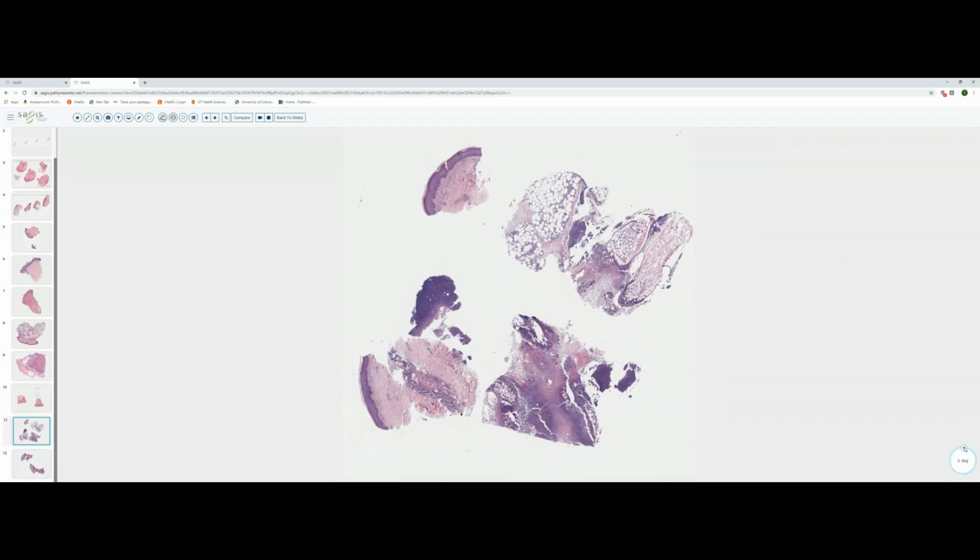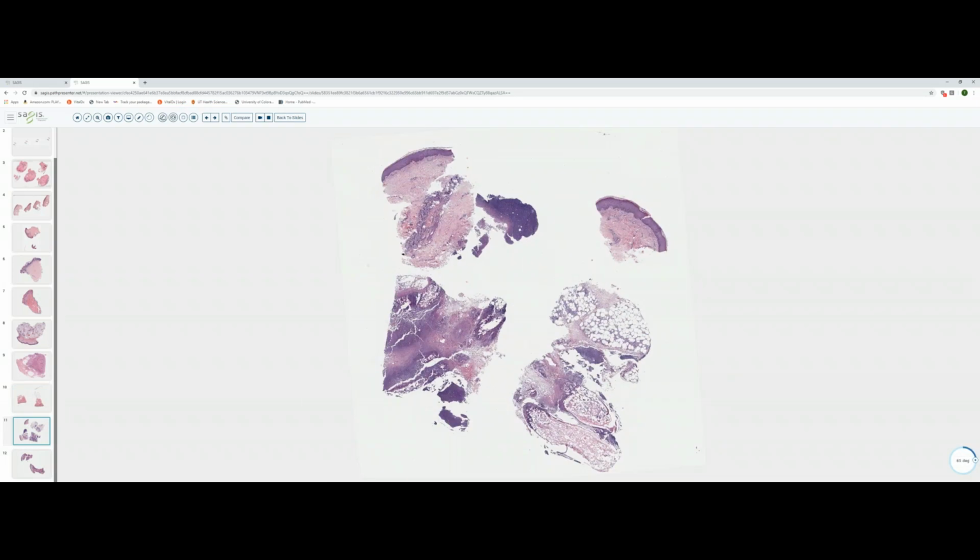The next case, punch biopsy. Obviously fairly deep. There's a little bit of inflammation in the dermis, but the compartment of the skin that is really trashed here is the fat. So we've got a panniculitis, and when looking at panniculitis, we need to decide where the center of gravity is.